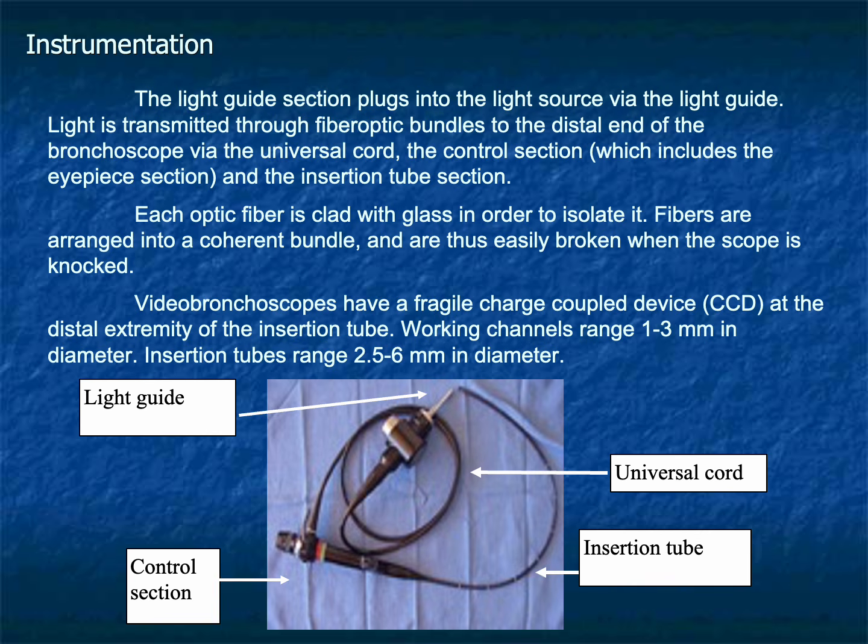In the past, broken fibers produced black defects within the image. Damage to control mechanisms affected maneuverability. A compromised scope will alter perception itself. The bronchoscopist, therefore, develops respect not only for anatomy, but also for equipment. Technical care becomes part of procedural competence.